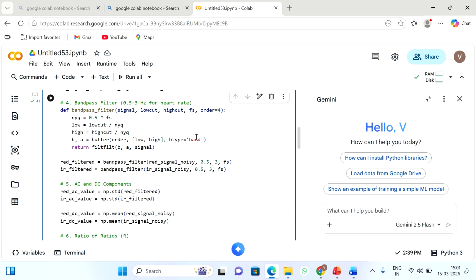And then the Butterworth filter type is taken as band pass filter. So it will have a lower cutoff frequency and an upper cutoff frequency. Below the lower cutoff frequency, all will be removed. In the same way, components higher than the higher cutoff frequency will be assumed as noise, because noise means low in amplitude, but the frequency will be higher. So they have to be removed. In between these two, the signal frequencies ranging between 0.5 to 3 Hz will be considered as pass band, and they are allowed to enter into the band pass filter.